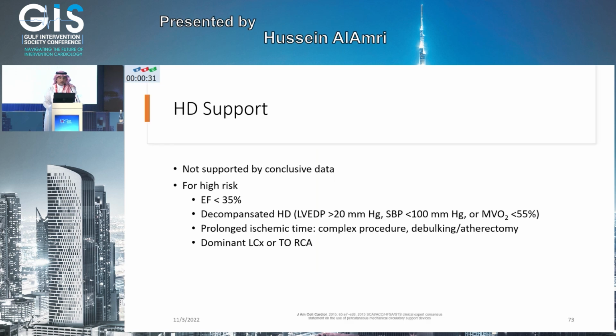Dual antiplatelet therapy at least for 12 months according to ESC. And hemodynamic support, you have to consider it in patients who are high risk. And if you decide to use it, you have to use it upfront.